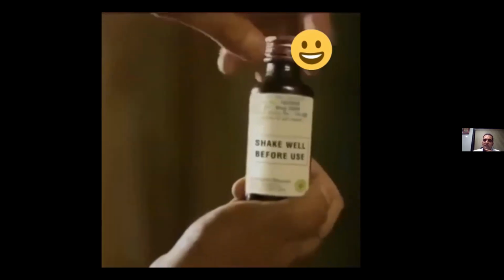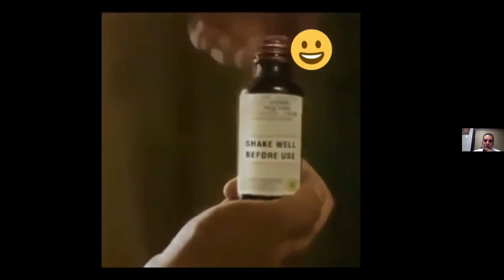It is not just by seeing the anatomy and the views and the windows. You have to practice, and we will do that. You people will do that for the next week. But read the instructions very stringently and try to correlate. Don't do the hard work without correlating the instructions well.